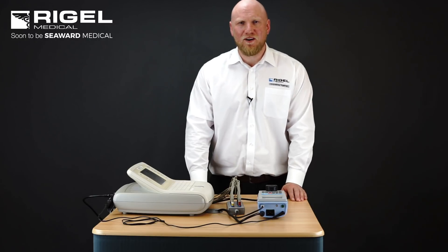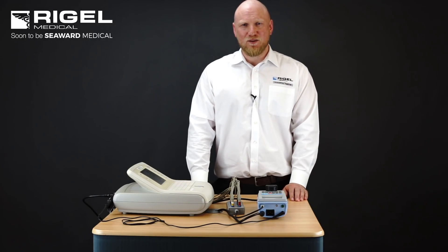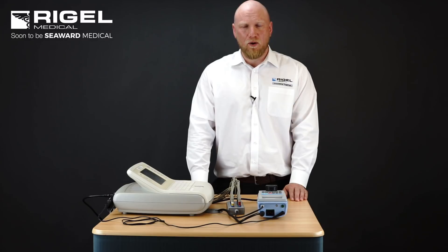The Rigel 288 Plus is an electrical safety analyzer. Its main features are that it tests to IEC 60601, IEC 62353, NFPA 99 and IEC 61010. It is mains or battery powered. It provides leakage testing, insulation testing and earth/ground bond testing to satisfy the standards.